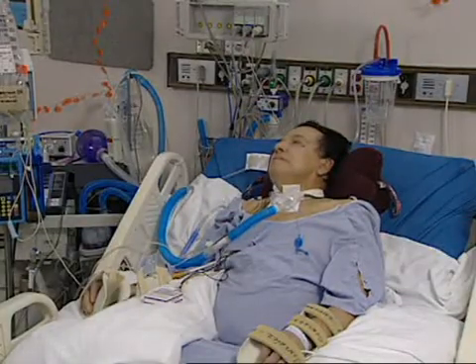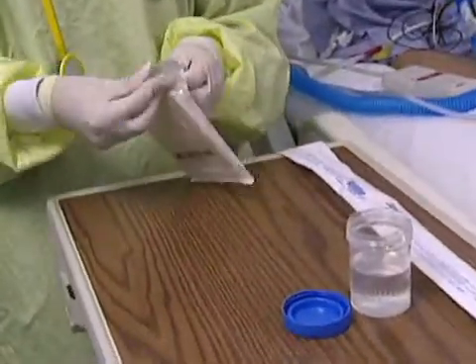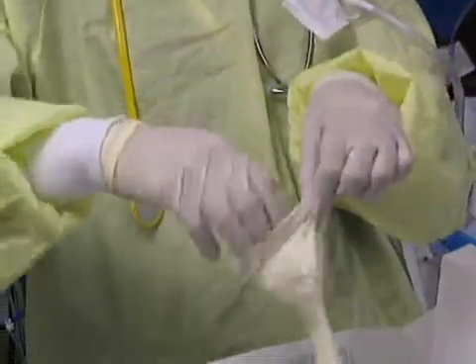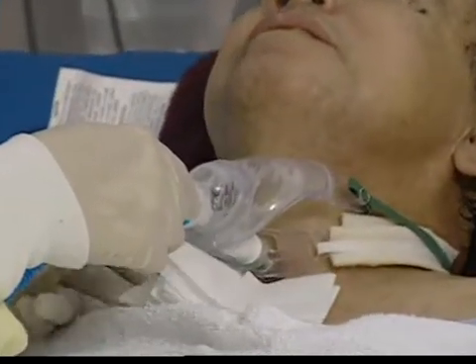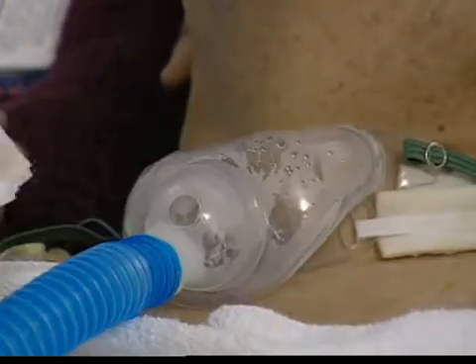Mr. Gonzalez is on contact precautions, and his nurse wears clean gloves during each care procedure. Here, she applies a sterile glove over the clean glove on her dominant hand to perform tracheostomy care. Resistance, I hit the carina. Suction the tracheostomy, then carefully remove the soiled dressing around the tracheostomy tube. Discard the dressing, suction catheter, and gloves in the appropriate receptacle.